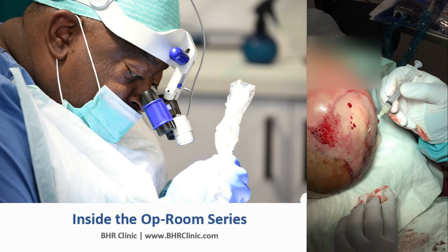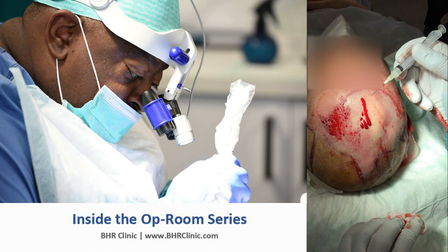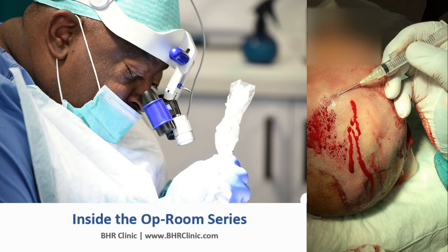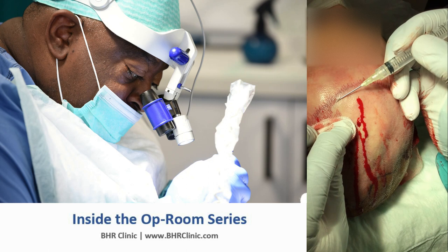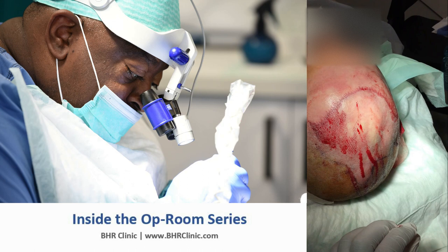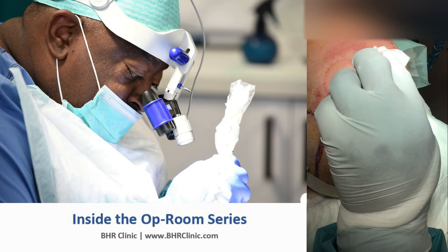Obviously the type of graft you place is also important. We try to place a lot of threes and fours in the middle because the patient has them, with single hairs at the hairline, ones and twos in what we call the transition zone, and then threes and twos further back for volume. This is how we do graft distribution during a hair transplant.